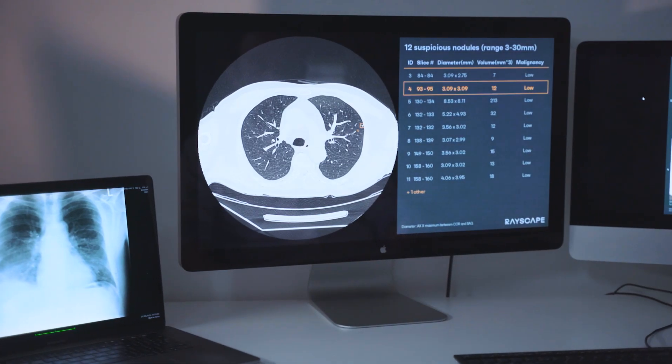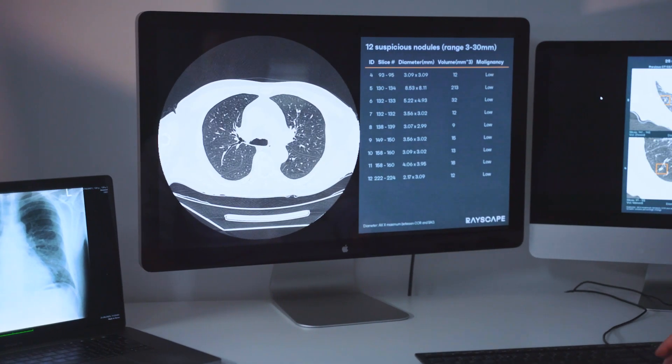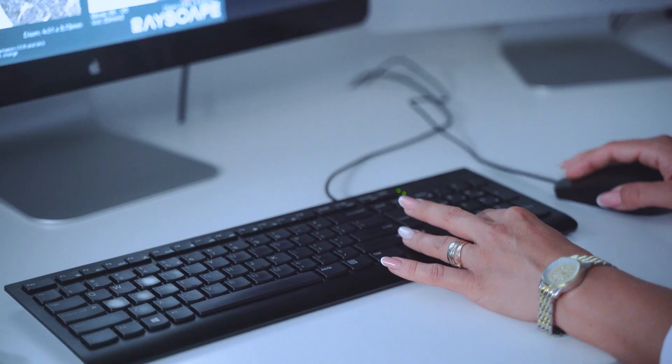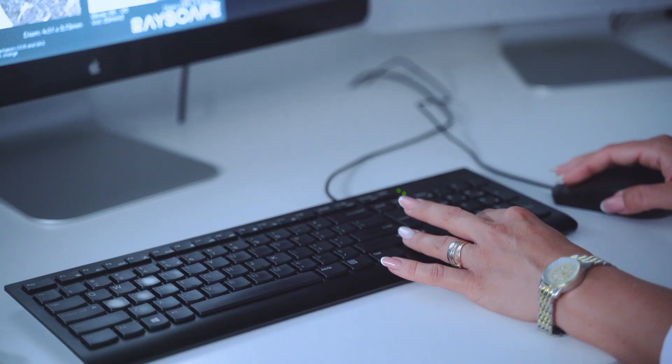Rayscape is the complete digital assistant that provides radiologists an artificial intelligence tool for better decision-making.